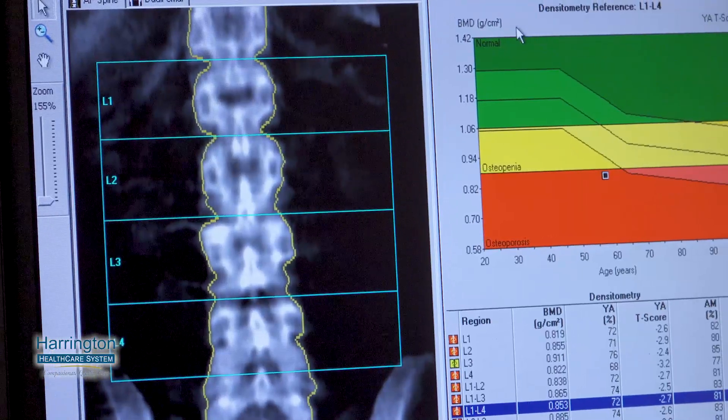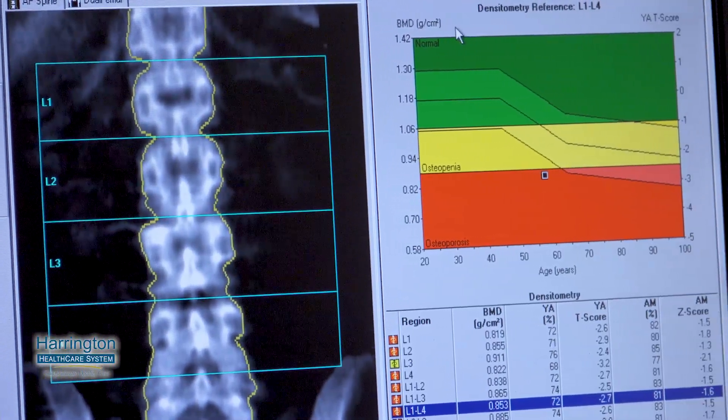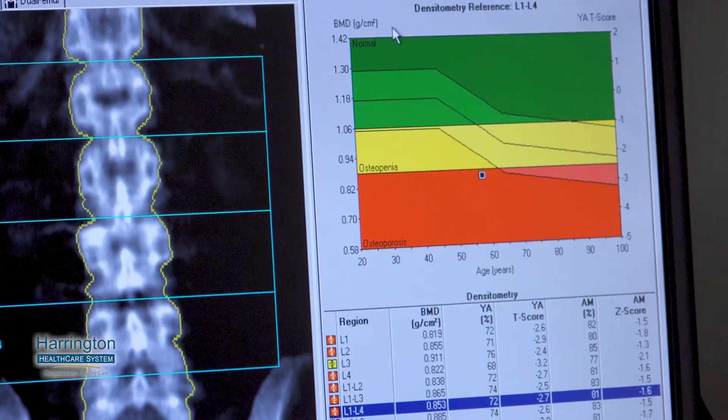We actually have to run the scanner right from the computer next to it. I think it's picking up more — a lot more doctors are aware of it and are sending their patients to be screened, women at post-menopausal time or for other reasons. So I think we're doing more now than we ever did.